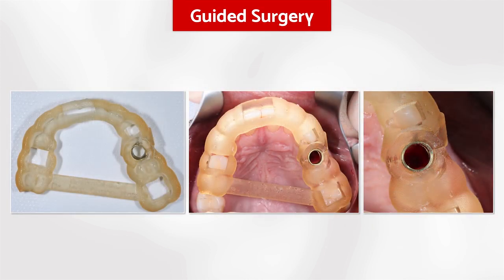After this tooth was extracted, it was inserted here a guide. We check through the special windows the good adaptation of this guided surgery over the teeth.